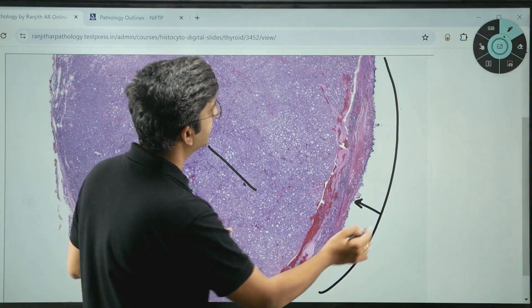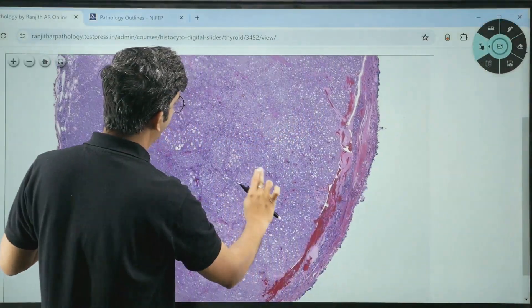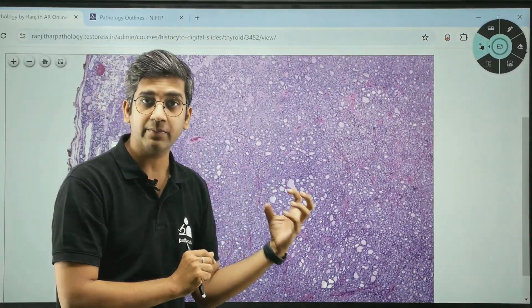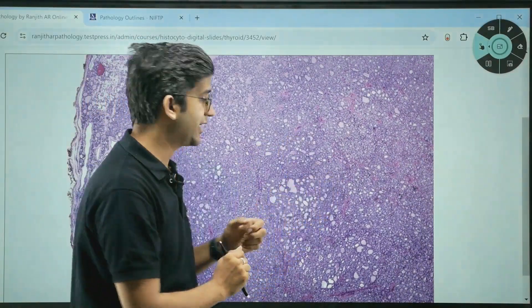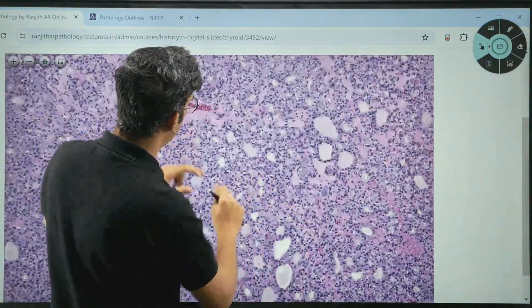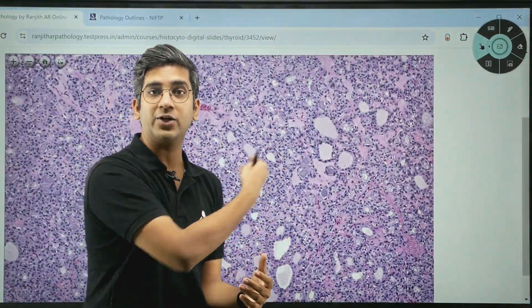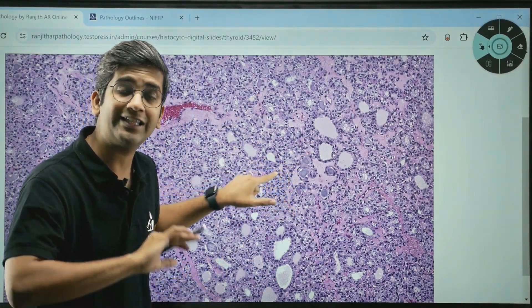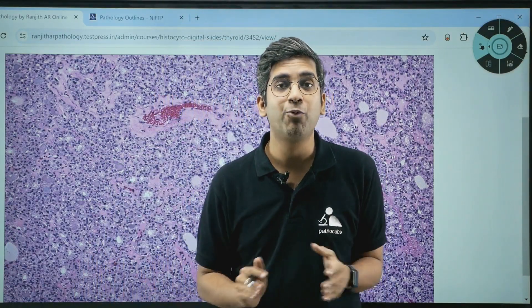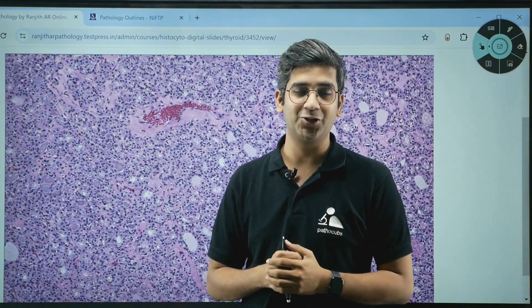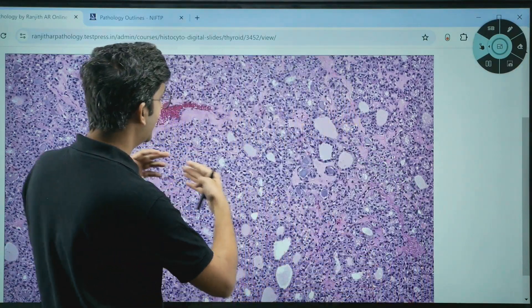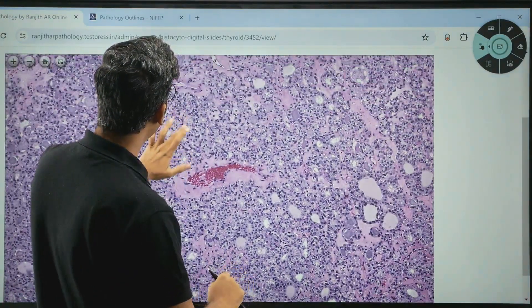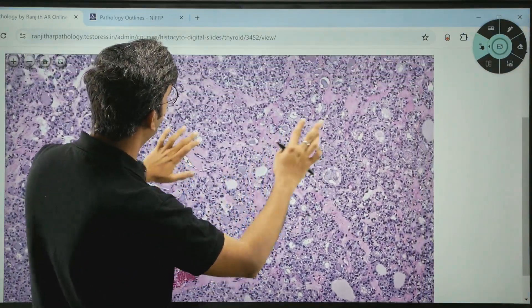If you zoom through this area, what you are primarily seeing is nothing but follicular architecture. Zooming in further, these are nothing but repetitive micro follicles — tiny, tiny follicles. You might see gummy, sticky colloid, which is a minor criteria. But the most important criteria is the repetitive micro follicles. The entire neoplasm is made of repetitive micro follicles. You won't see any amount of papillary architecture at any point.